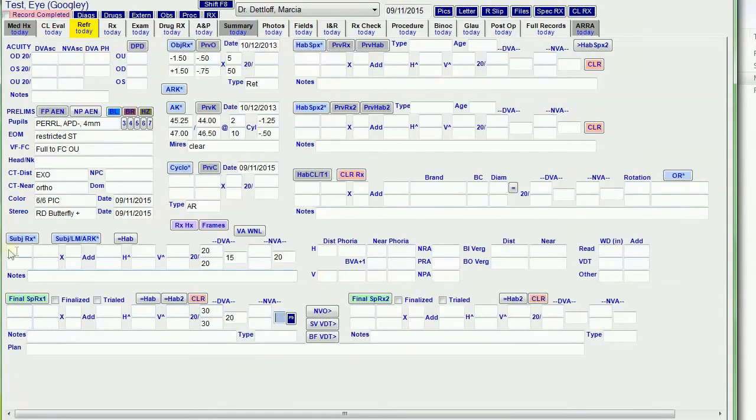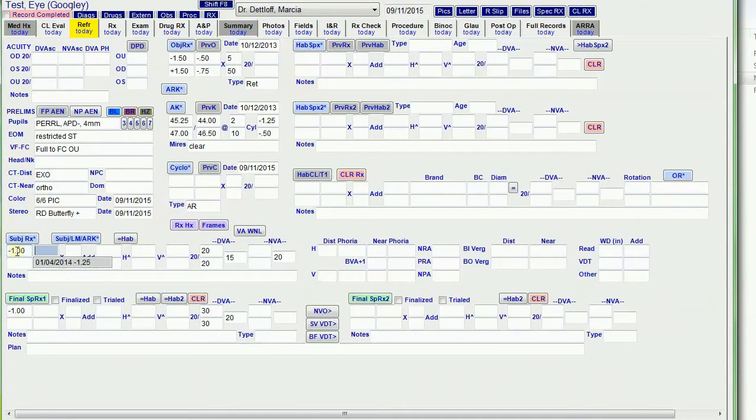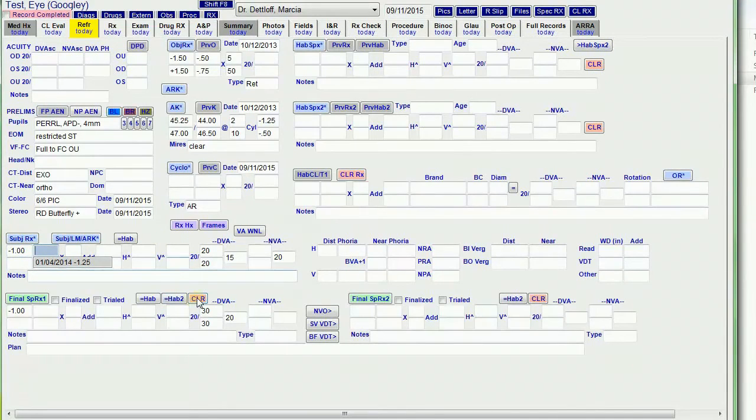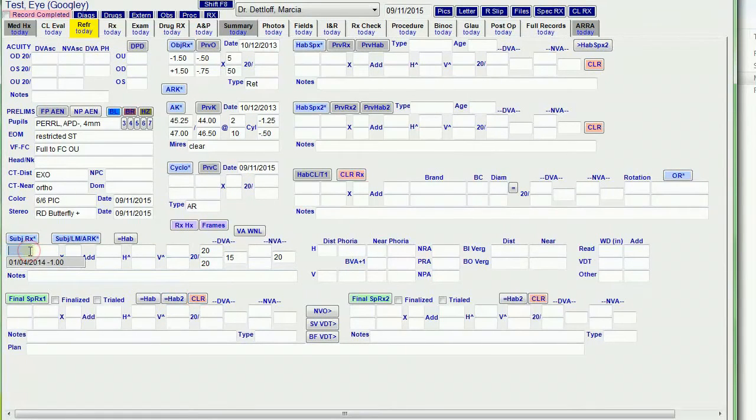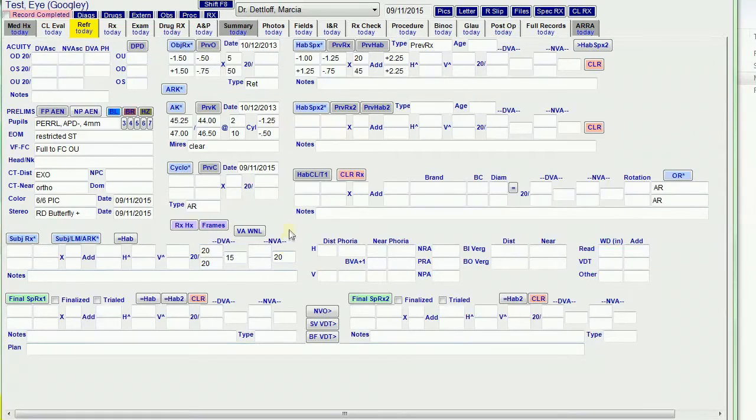Same thing, the subjective RX copies down to the final RX. And I'm going to clear this. I don't have a clear button for this. So I'm going to push some buttons to fill in some data here.